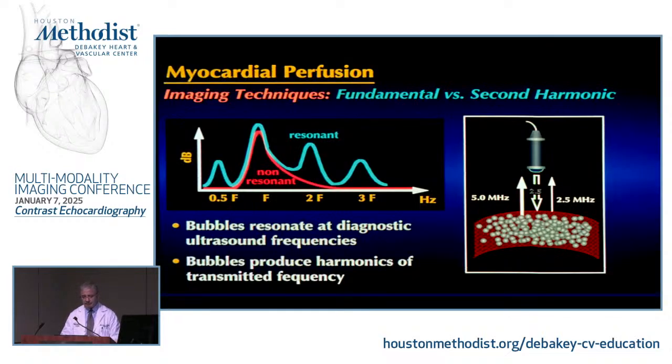Well, in ultrasound, we also talk about harmonic imaging, right? We talked about that in the basics of ultrasound. I think this is very important because harmonic imaging was developed early on for contrast. Why? Because interestingly enough, if you hit these microbubbles with ultrasound, they will vibrate. And with their vibration, they will emit the similar fundamental frequency that you are imaging.